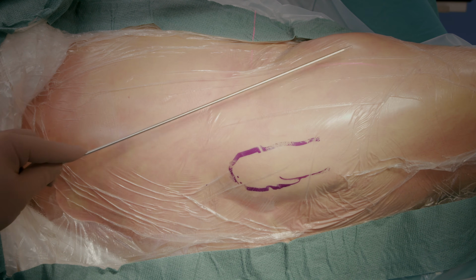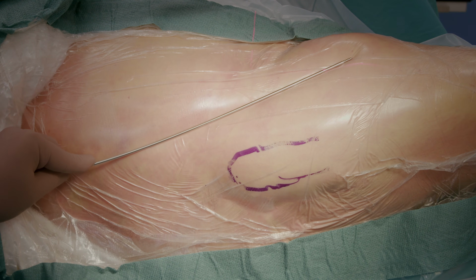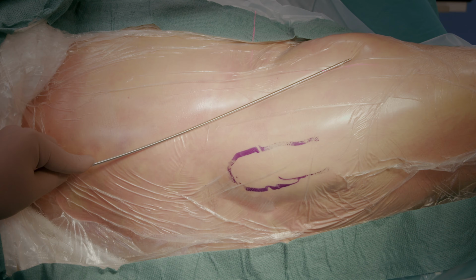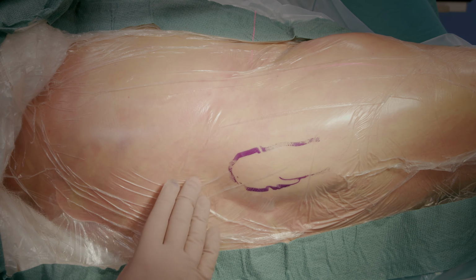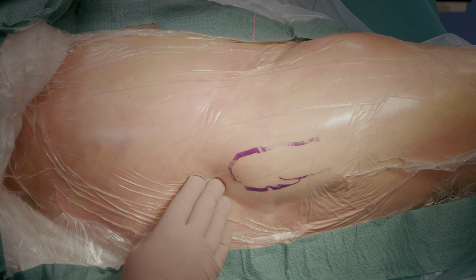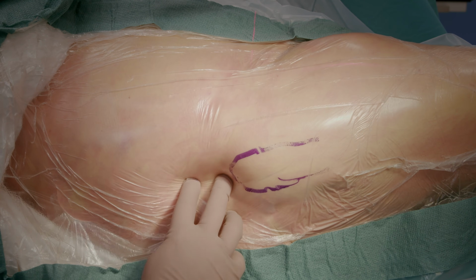To get a better idea of the level, we can use a guide wire like this. We place it here on the anterior femoral surface, then we take an image. It shows that the incision will be well on the proximal side of the tip of the greater trochanter. The amount of subcutaneous tissue in the hip area will affect how far obliquely above the tip of the greater trochanter you need to approach and how far proximally you need to make the incision. This is a fairly slim patient, so a few centimeters will be enough.